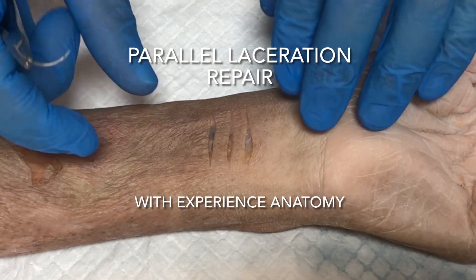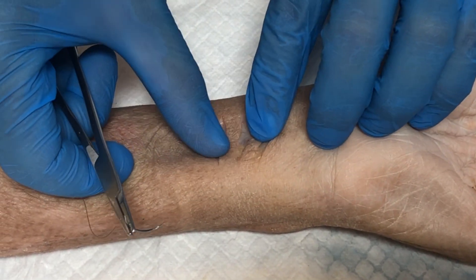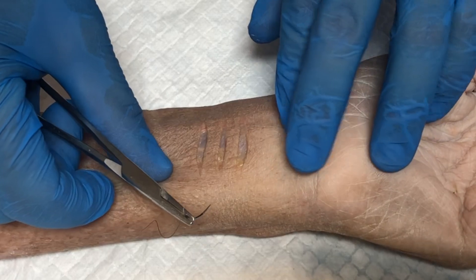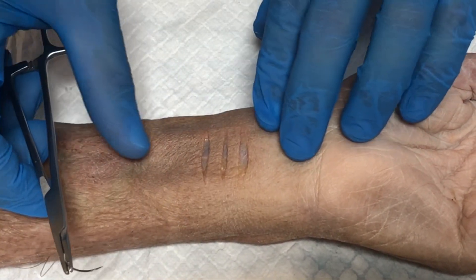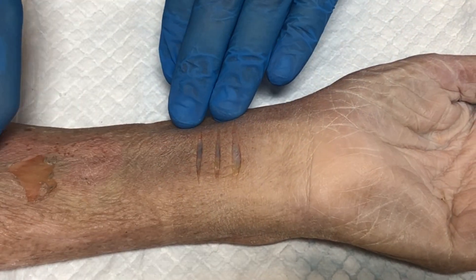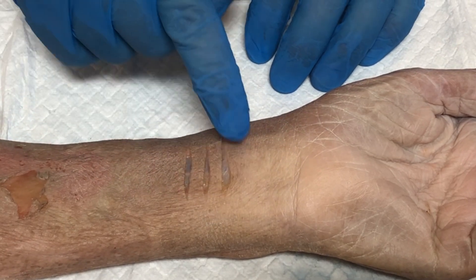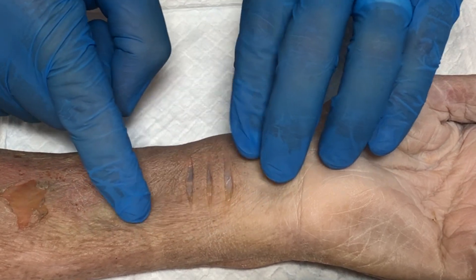This is a laceration simulation — we're simulating somebody who may have intentionally cut themselves, such as a cutting, suicide attempt, or self-harm scenario. You may see this on occasion in patients with psychiatric illness, but you may also see a similar presentation for somebody whose arm went through a window, barbed wire, or razor wire. This is the concept of parallel lacerations.